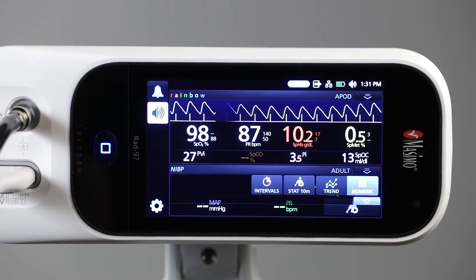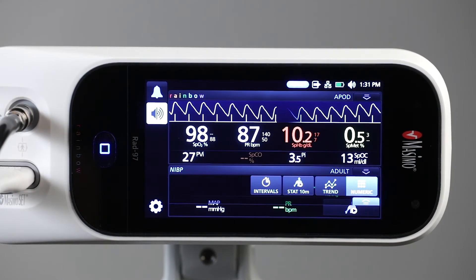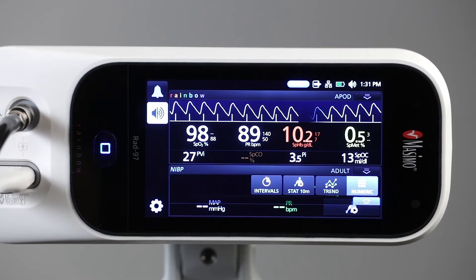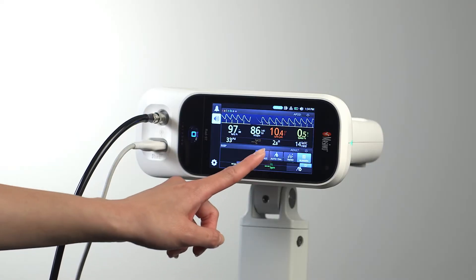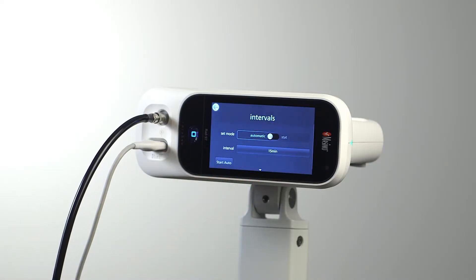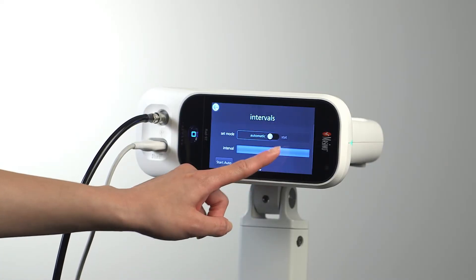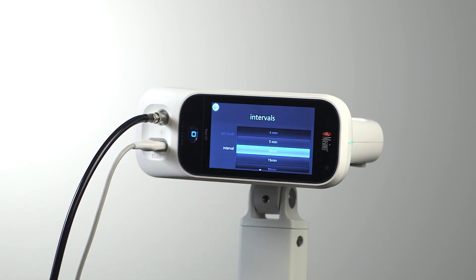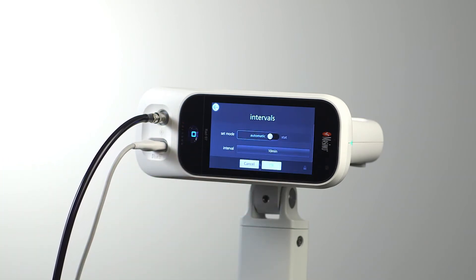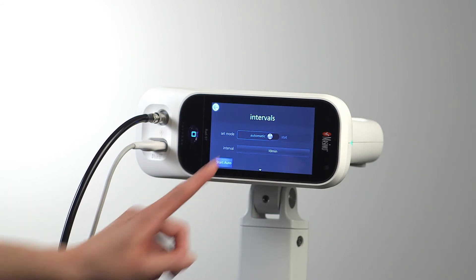There are three NIBP measurement modes to select from: automatic interval, stat interval, and spot check. Automatic interval mode sets the RAD 97 to obtain NIBP measurements every desired interval as selected by the clinician. Once 'Start Auto' is selected, measurements will begin.